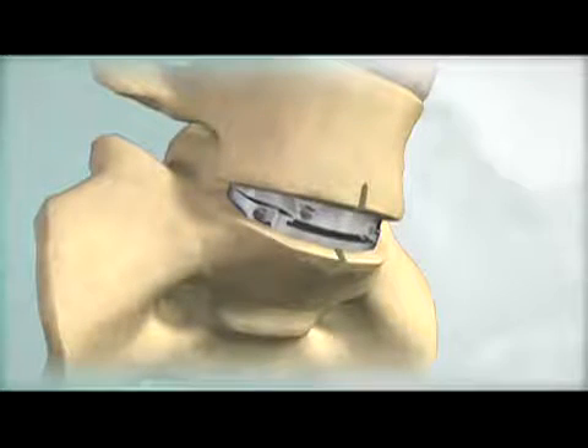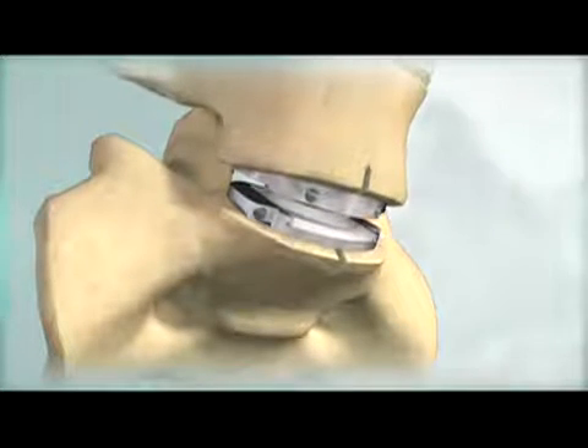The ProDisc-L end plates are inserted in a collapsed position and then distracted for the polyethylene inlay insertion. This modular technique facilitates end plate insertion and provides controlled distraction for polyethylene inlay assembly.